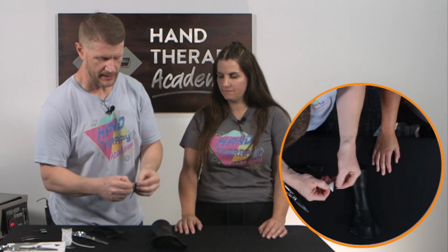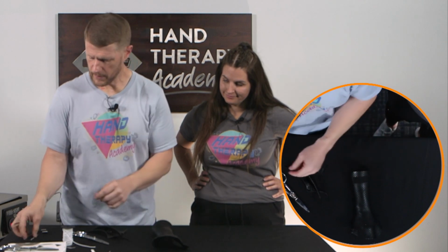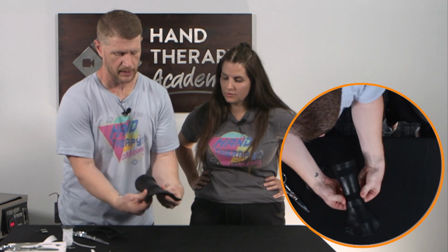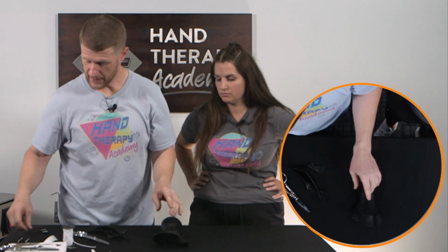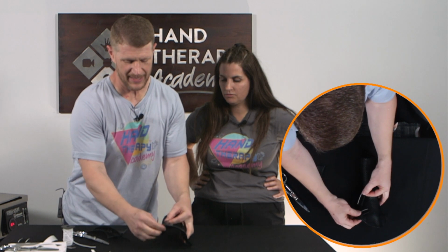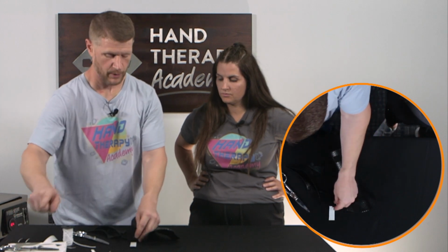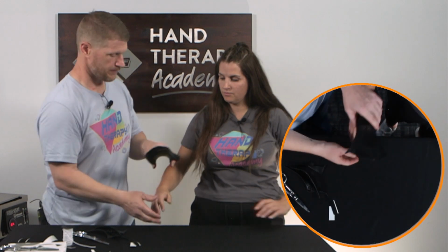I'm going to put our adhesive back hook on the proximal forearm, distal forearm proximal to the wrist crease, so kind of over that ulnar styloid where that little area was. And then eventually I'll take these two pieces and put them down here, and they'll run at different angles. Then I have another piece that I'll put for the thumb that will receive this 1/2 inch Velcro, or the stretchy 1/2 inch strap. But first I want to put this back on her.